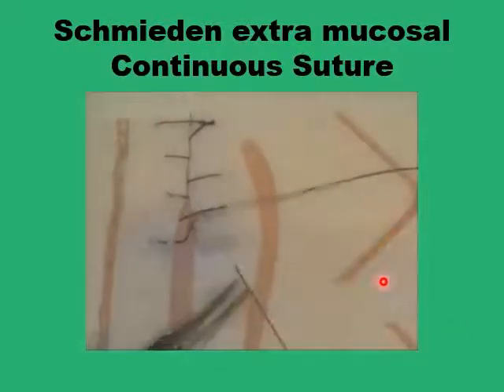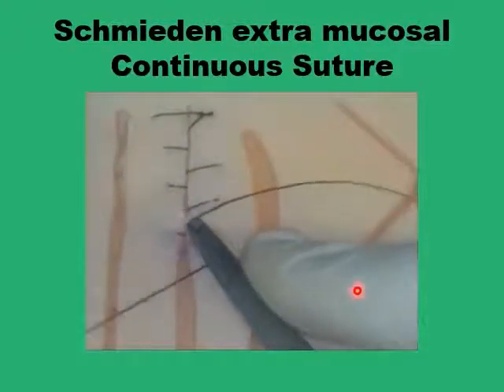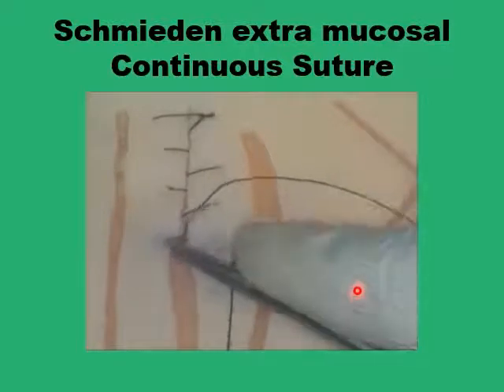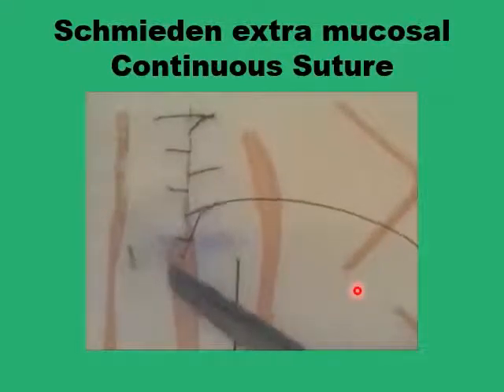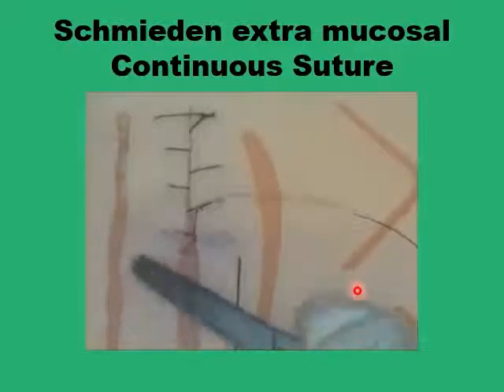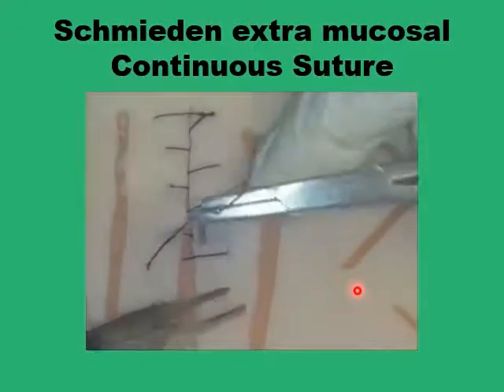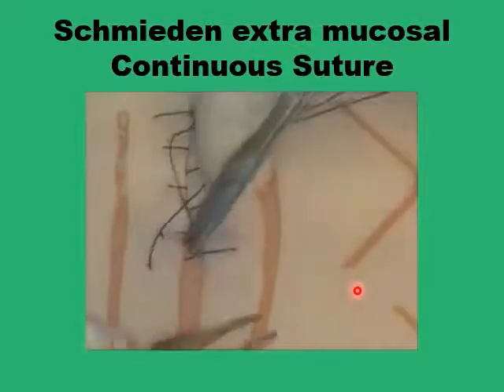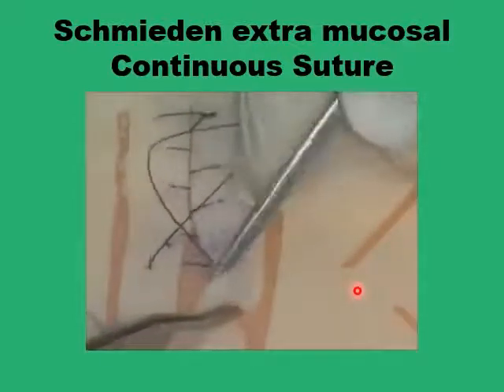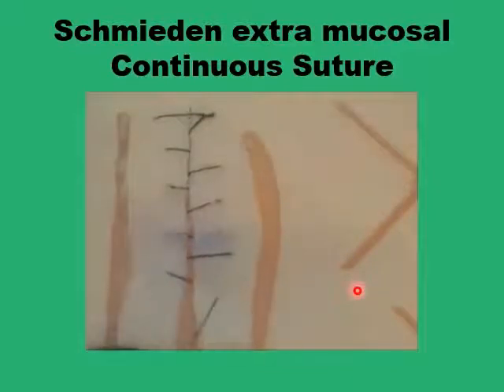It is quick because you only have two punctures at every level. Compared for example to the Lampert, you have four punctures per level. You advance with each level quicker and also save more on your suture. By avoiding any mucosal puncture you decrease the incidence of leak and postoperative infection and morbidities.